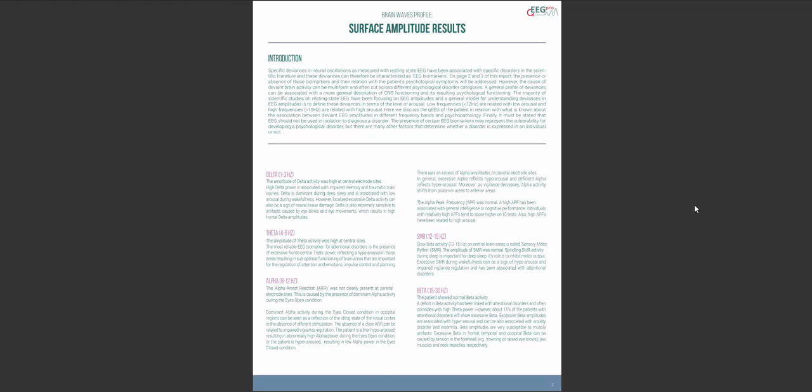For theta you'll again see whether theta activity is normal or abnormally high or low followed by an explanatory text about which disorders are associated with deviances in theta.